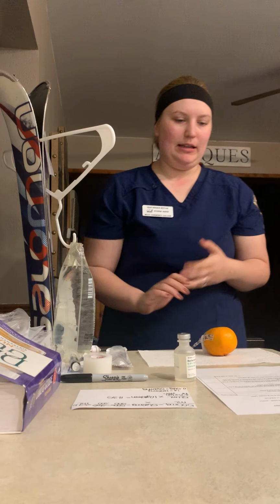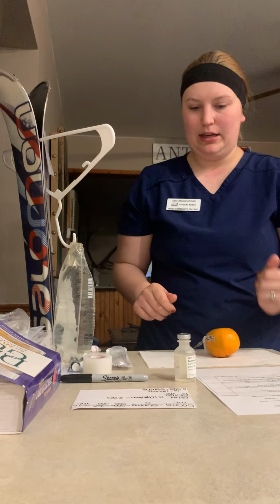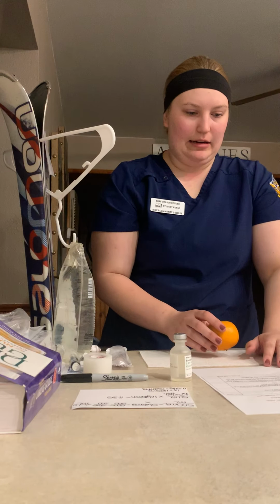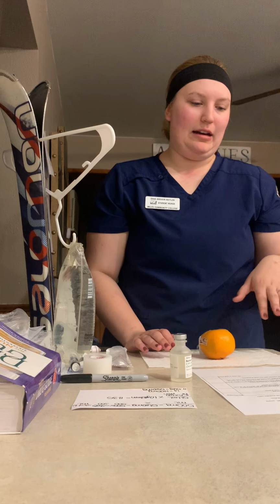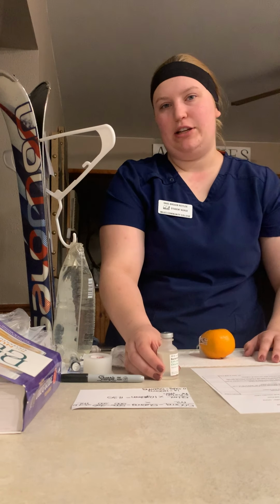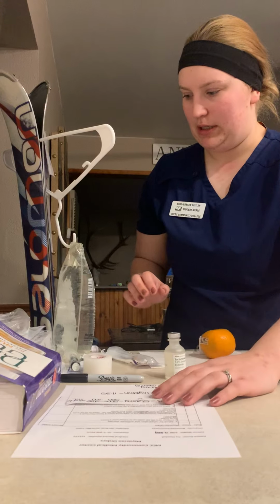I'm going to wash my hands, introduce myself, check the patient's name and date of birth. I'm going to double check those allergies. Make sure I got my right medicine, it's the right time, got the right dose, right route. And before I do anything, I'm just going to explain to my patient what this medication is for and explain that it is for his bronchial pneumonia, and make sure he understands that and give him some education on side effects, stuff like that.